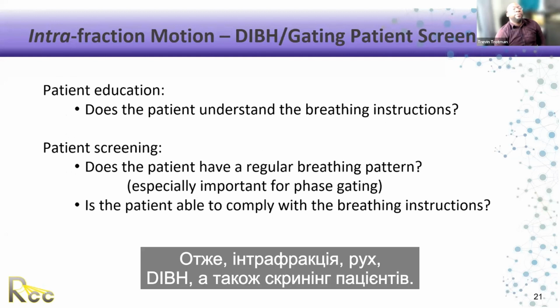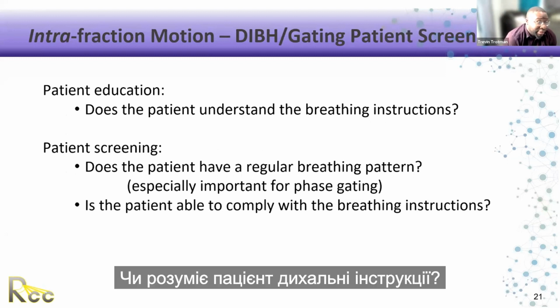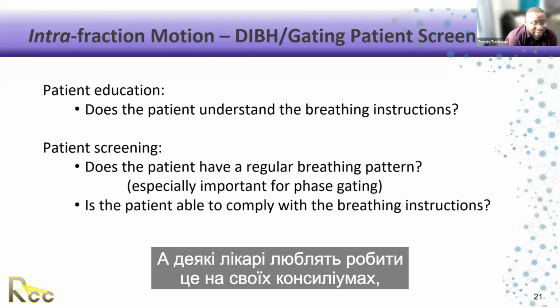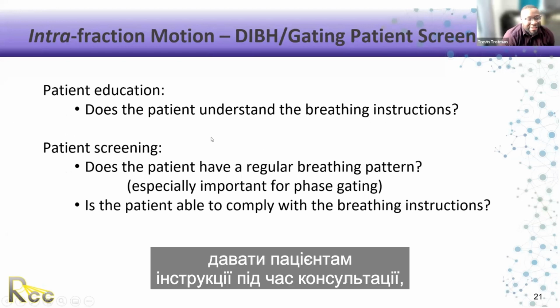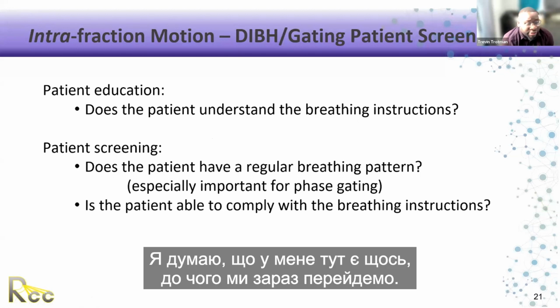So intrafraction motion, DIBH, and gating patient screening. So we have patient education. Does the patient understand the breathing instructions? It's important for you to have patient education. And for some of us, some MDs like to do it at their console, and also like to give patients instructions at the time of consult to help with these breathing instructions. I think I have something on here that we'll go over too.